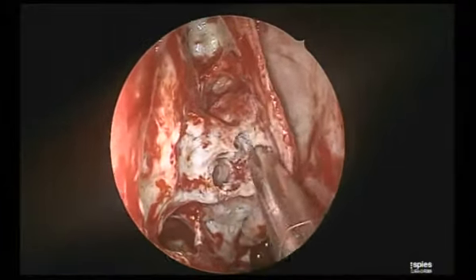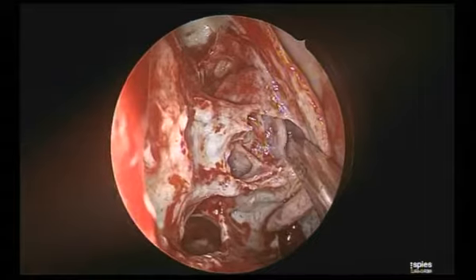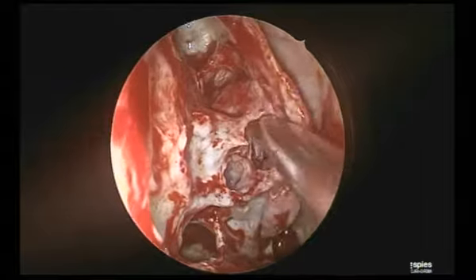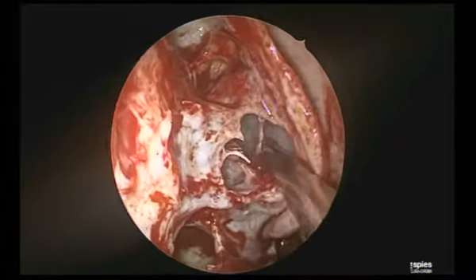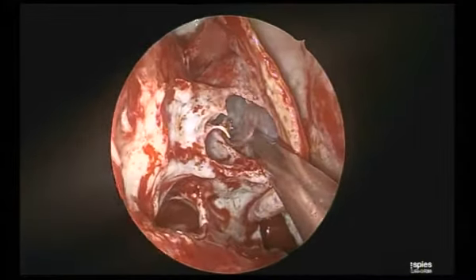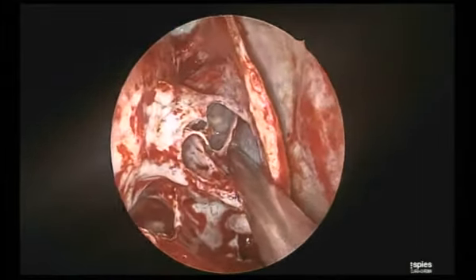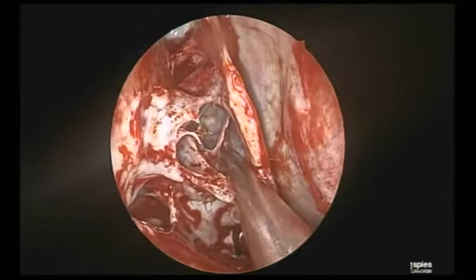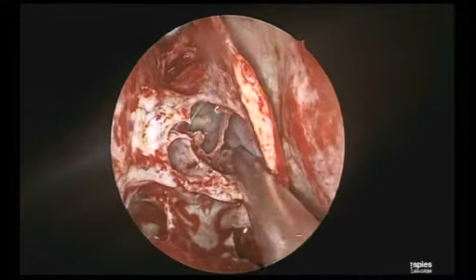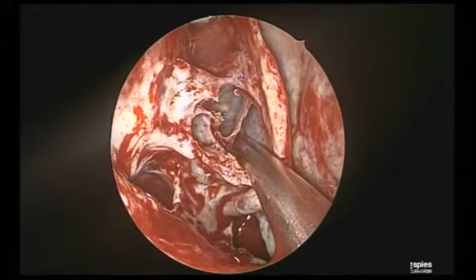What I need to look for is, see that is the superior turbinate. Yes, it has come in. Go medial to it. If my suction doesn't stop, I'll finish in 3 minutes. Yes, we see the sphenoid. We see the sphenoid opening. There. See this. One can easily get confused with this. Go medial to the superior turbinate. That's our landmark. And see what I was looking for next, the upper border of the maxillary.